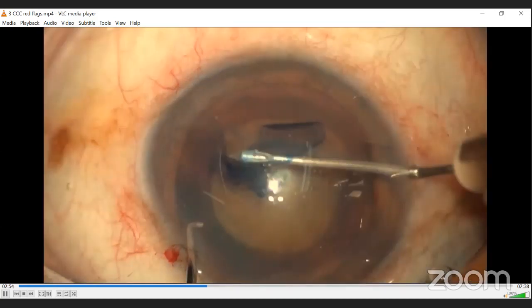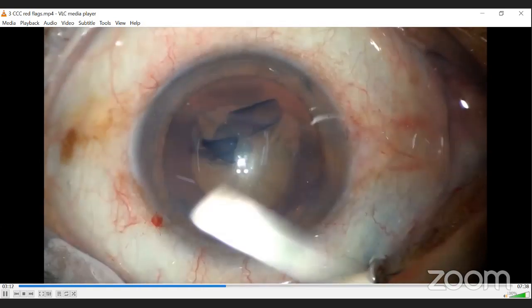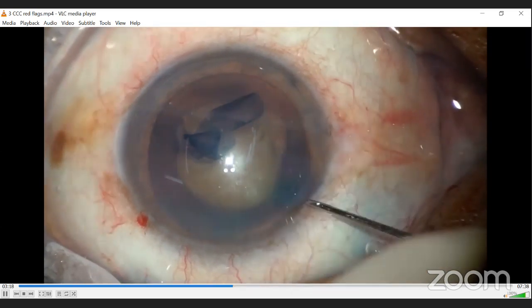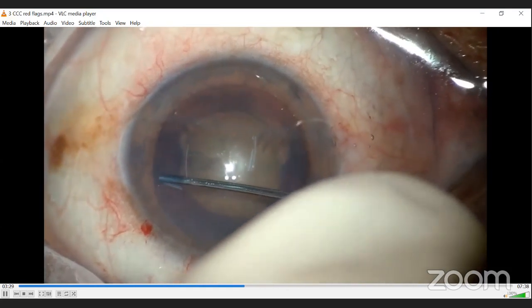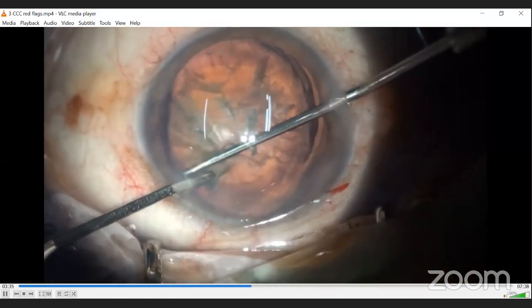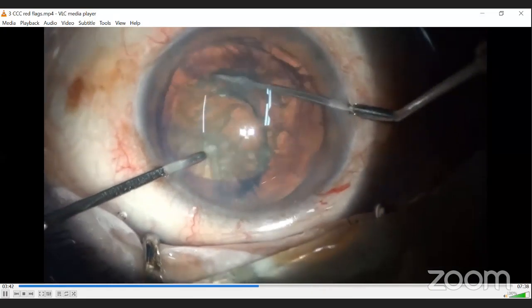And what you see here, I felt there was a V-shaped tear there. But the surgeon was quite confident. He said, no, I completed the rhexis. I don't think it's anything, maybe just some disturbance in the cortex. And as he said that, the rhexis is now complete. So let me proceed with hydrodissection. So he went in, pushed some fluid, the flap was a free flap, so it came out. Very good. So now he is proceeding with hydrodissection, and now he is trying to rotate the nucleus, and he could rotate it. And now what happened there?